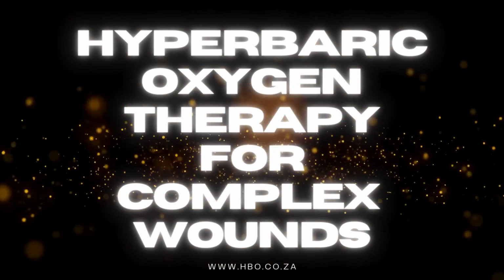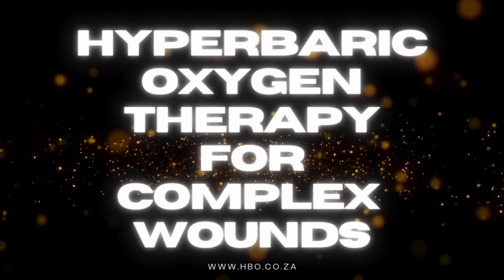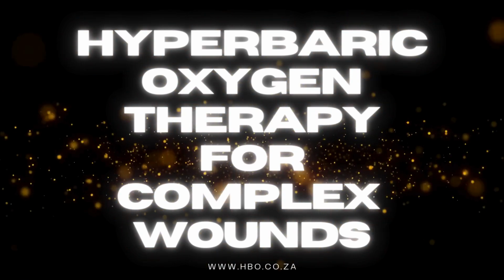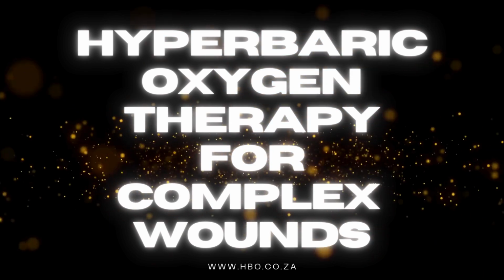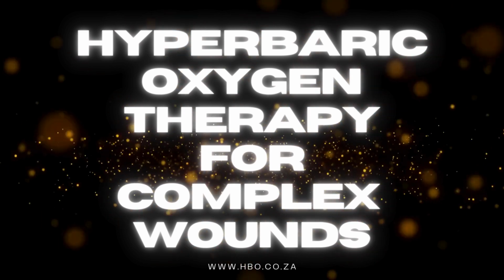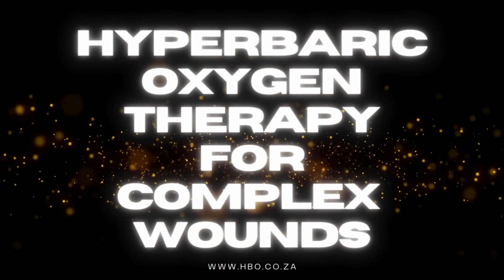So, if we were to boil it down, what's the main takeaway message about HBO for these difficult wounds? I think the key point is this. For complex wounds, especially like diabetic foot ulcers, where that lack of oxygen is a major barrier to healing, HBO offers a specific way to tackle that core problem. By flooding the tissues with oxygen.